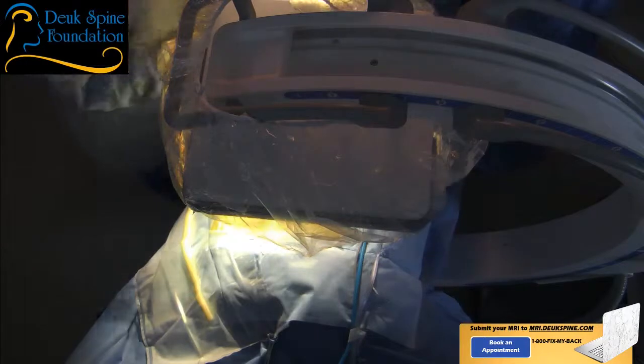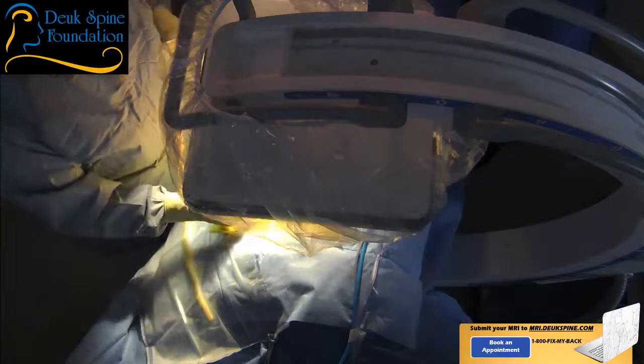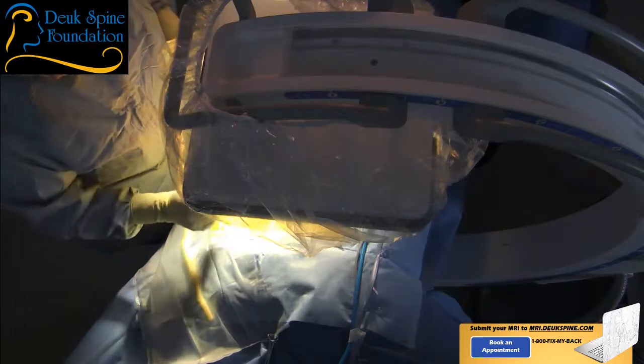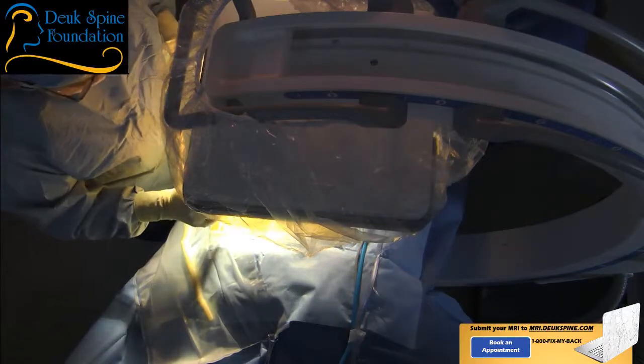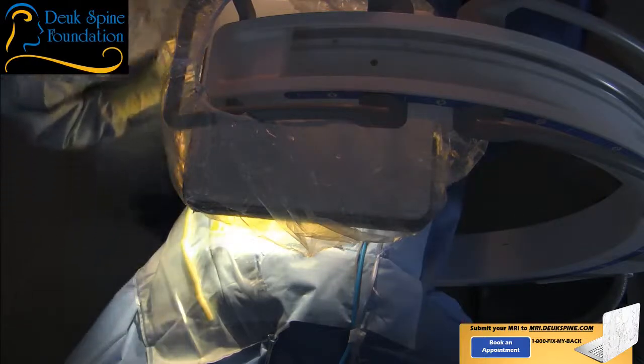All right. We have to use a little more of the numbing medicine in the skin and stuff because we can't sedate you as much. I talked to your cardiologist. Where's our blood pressure? 148. Anything we can do to bring it down? Yeah. I'd love to get it around 110. All right, shot.